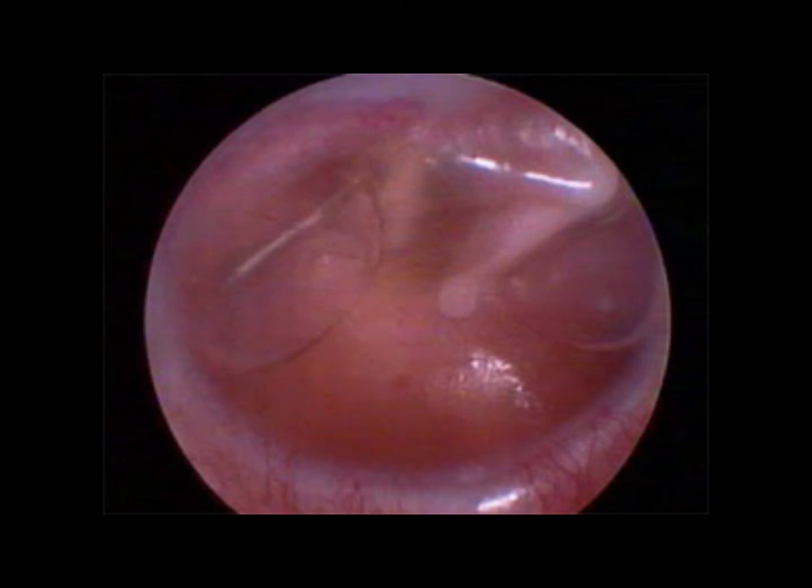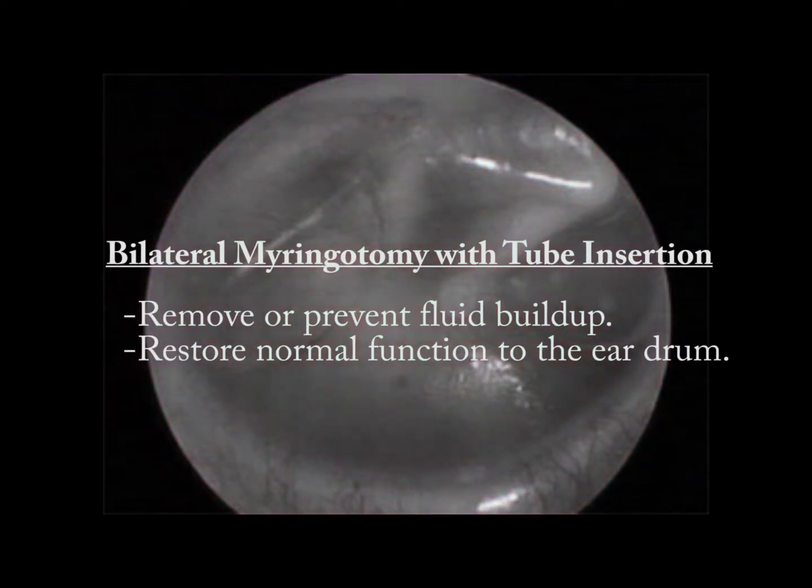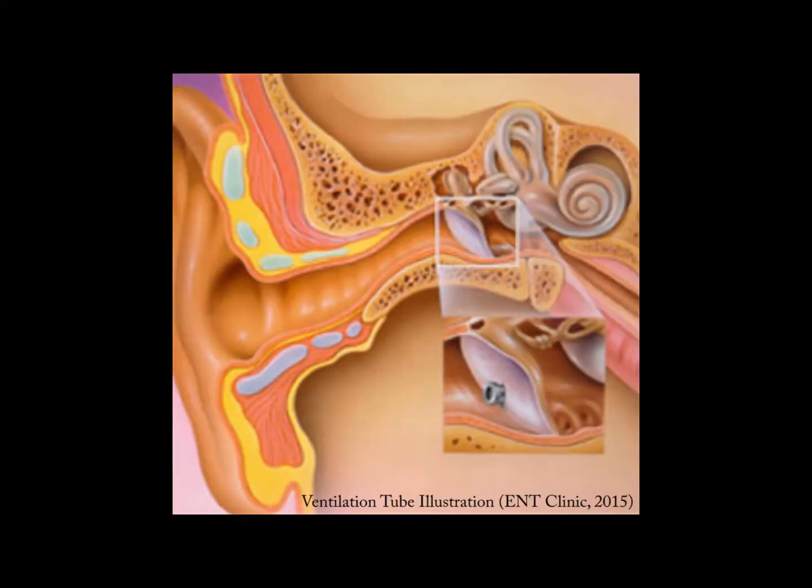An ENT surgeon may perform a bilateral myringotomy with tube insertion in order to remove or prevent fluid buildup, as well as to maintain the normal, proper function of the eardrum by removing the force pressed upon it by the fluid. This is usually a quick, non-invasive procedure that only takes a couple of minutes to complete.